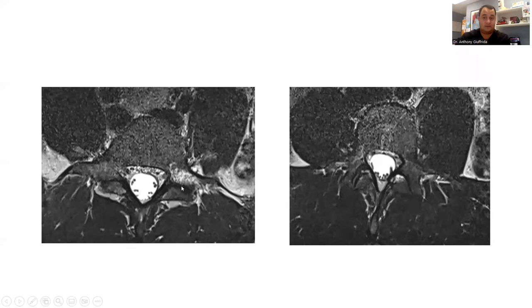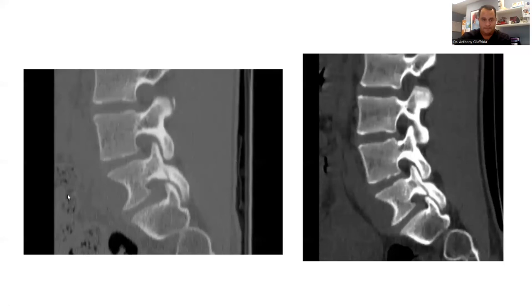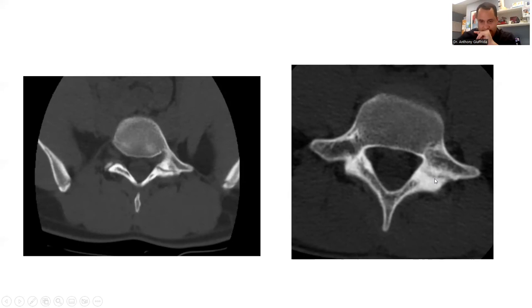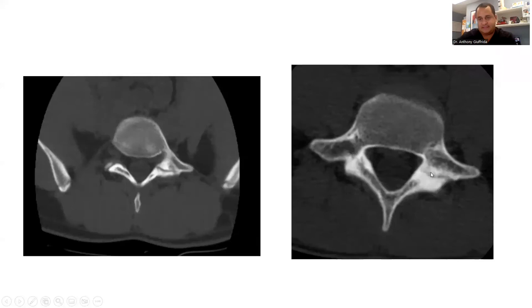I didn't see much on the axial at that upper level, but we got a follow-up CT scan. I shut him down — this time only for a week because he's in the middle of season, which I'll discuss at the end. Unfortunately, we have what looks like the same stress reaction as before. Comparing the old CT to the new one on the axials, what's interesting is we see a lot of sclerotic bone here — this area tried to heal. The discussion I've had is: is this a refracture, or did it never fully heal? I think we're going with the latter — it's kind of becoming a non-union, which is a little concerning for the long-term future of this player.